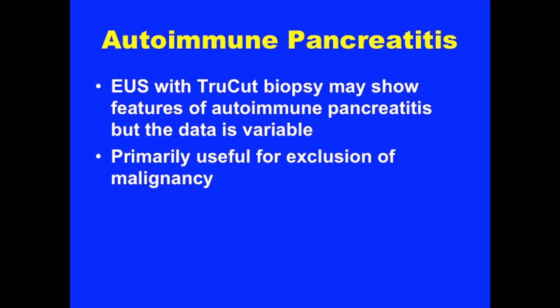The autoimmune pancreatitis has been discussed several times here, and the difficulty in making the diagnosis has been very well stated. We had a TrueCut biopsy needle that, when it worked, worked beautifully, and you had a large sample that would truly do histopathology. The problem was that it really didn't work all that well in everyone's hands, and we would make jokes about, you know, is the moon full or is our tongue positioned right when we're firing the needle, because that's how unpredictable the needle was. And that one has pretty much gone by the wayside.